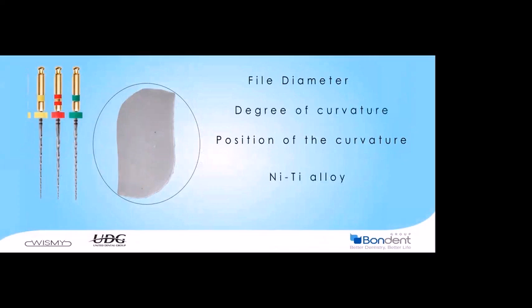So we have to know that whenever a file is in a curvature, it's going to be under cyclic fatigue stress. In order to decrease the fractures of the files due to cyclic fatigue, we have to know that these four factors, the diameter, the degree of curvature, the position of the curvature, and the NiTi alloy, can influence the cyclic fatigue resistance of the file.